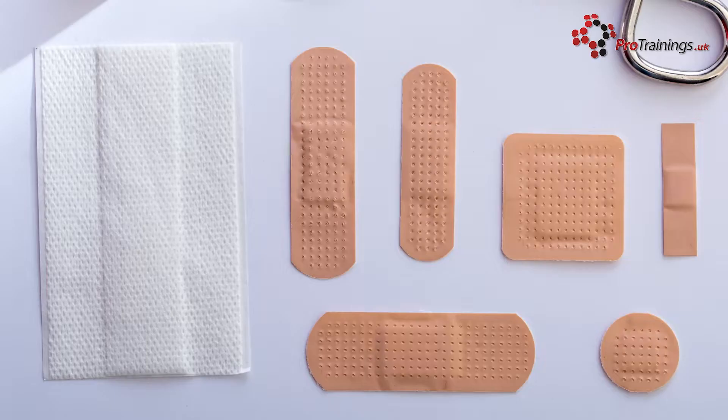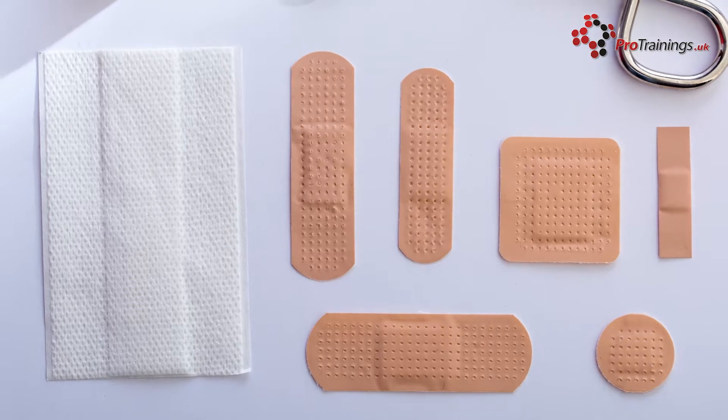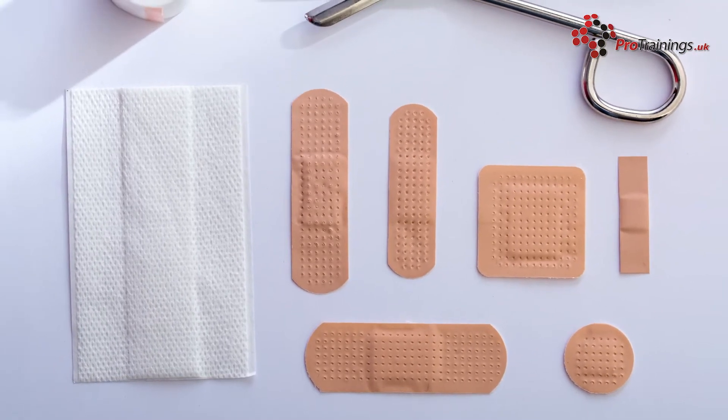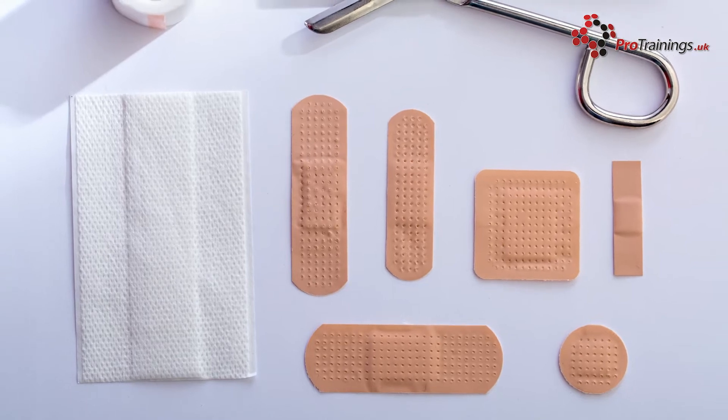Plasters are a simple way of protecting and keeping clean a small injury. There are different types and you need to select the right type and size. The main types are waterproof, fabric, or a gauze type. They come in different qualities, and these are higher quality with a superior adhesive giving more effective protection in all environments.